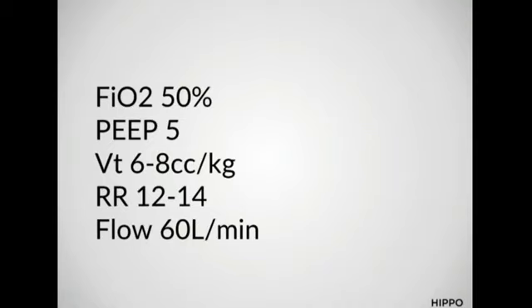So if you start at 60 and your patient still looks air hungry, maybe you turn them up to 70 and see how they look. Even 80 might be about as high as I would go on the standard patient. You can also go down a little. You could go down to 50 or 40 if they seem like they're getting blown away by whatever you've set.